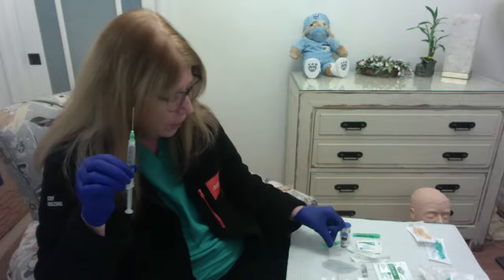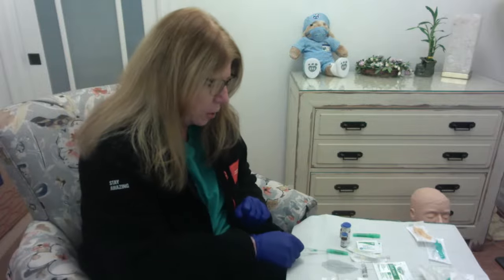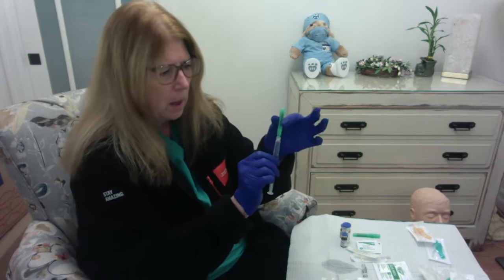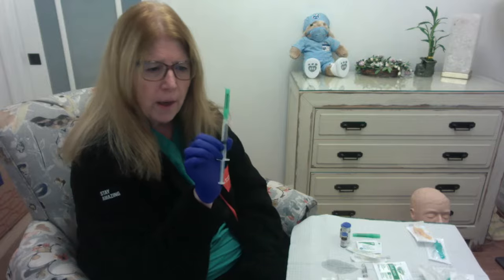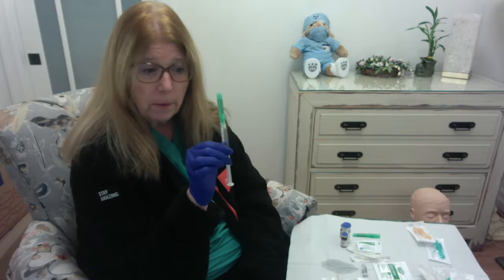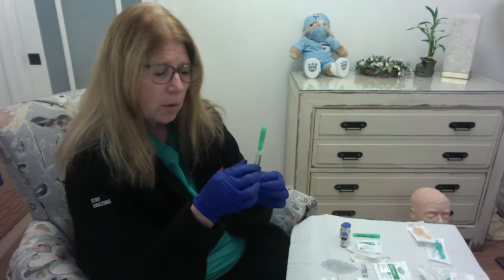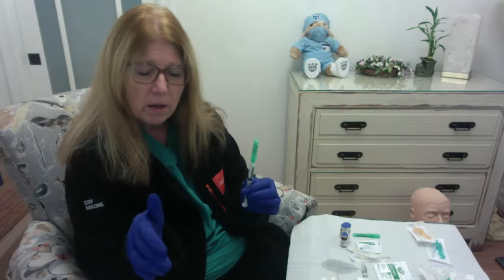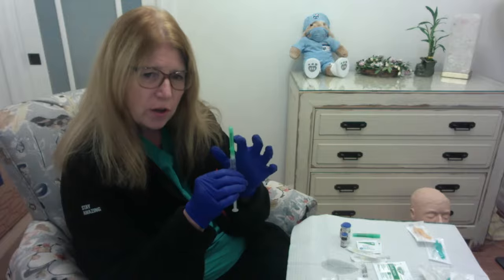So the cap goes down on the table, and one-handed, you pick up the cap with the needle, bring it upright, and then push the cap down. Okay, so this is now ready to give, whatever we're going to do with this medication. If we're going to inject it into a patient, or if we're going to inject it into a bag of IV fluid, we need to change this needle.